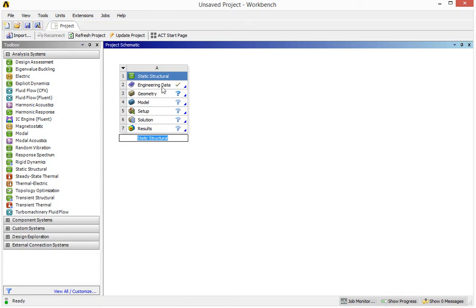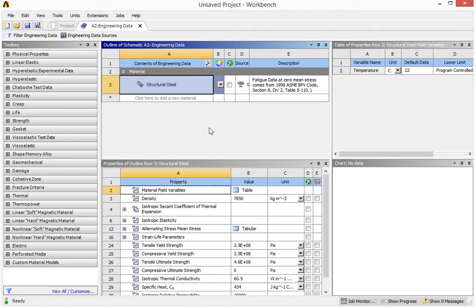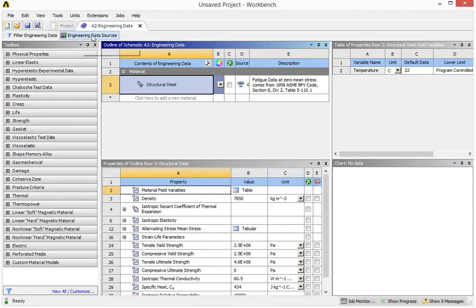But the first step is to get the engineering data. If you click on this engineering data, you'll see the ANSYS system gives you a default material, which is structural steel. It's been commonly used for engineering. But for us, for medical application, we may need stainless steel, we may need titanium. So in this case, we need to go to engineering data source to find out whether there's titanium already been used by the software.